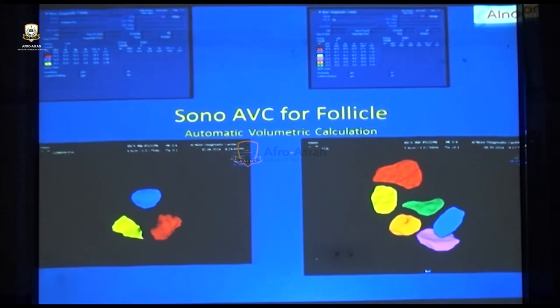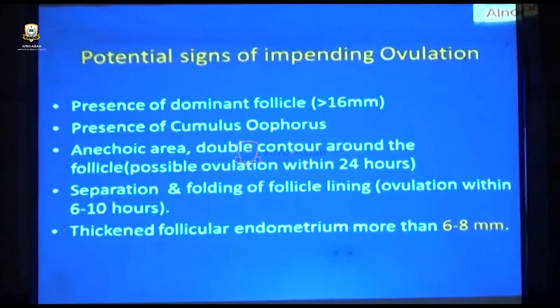Especially those who are going to have IVF or ICSI programs, where you want to take the follicles outside, you can count how many follicles there are. The gynecologist, by putting the needle inside, can take out the follicles and preserve them, giving the lady multiple chances to become pregnant if one chance fails, then the next.